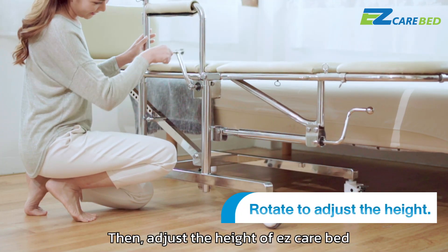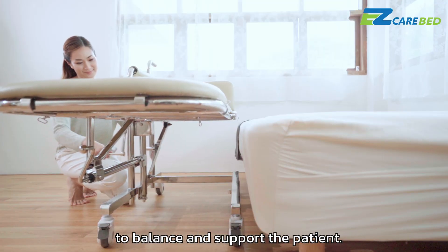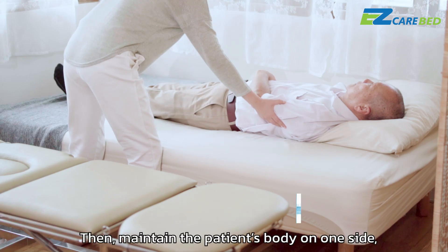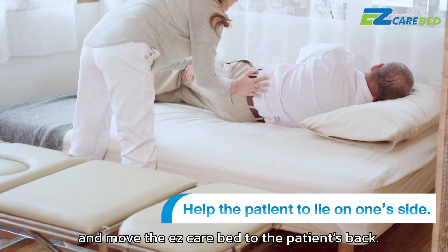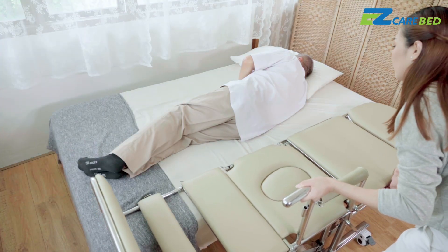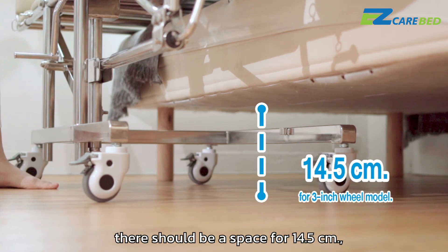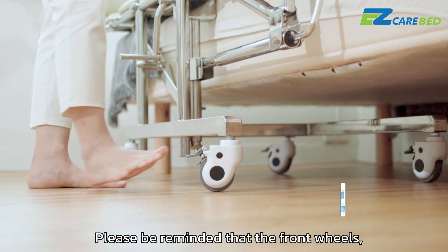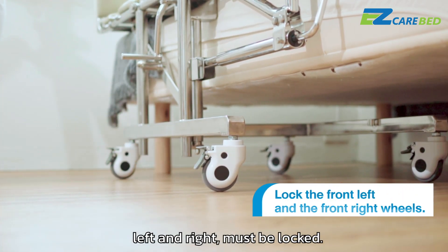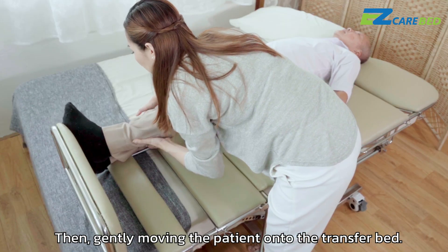Adjust the height of the Easy Care Bed to be higher than the destination bed to balance and support the patient. Then maintain the patient's body on one side and move the Easy Care Bed to the patient's back. For the 3-inch wheel model, there should be a space of 14.5 cm under the bed. Please be reminded that the front wheels — left and right — must be locked. Then gently move the patient onto the transfer bed.